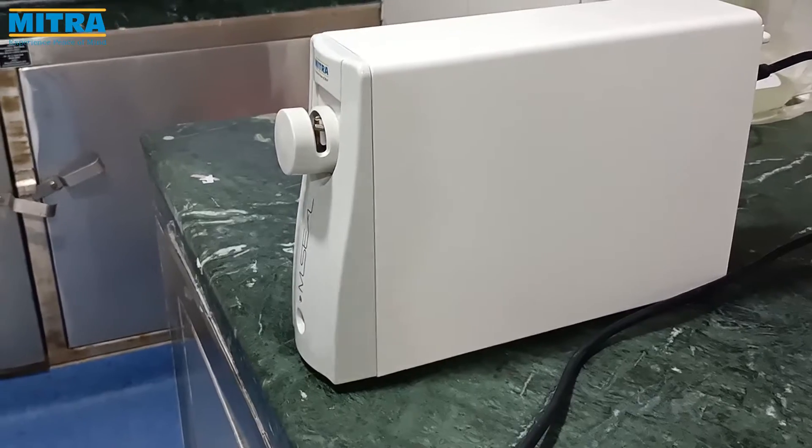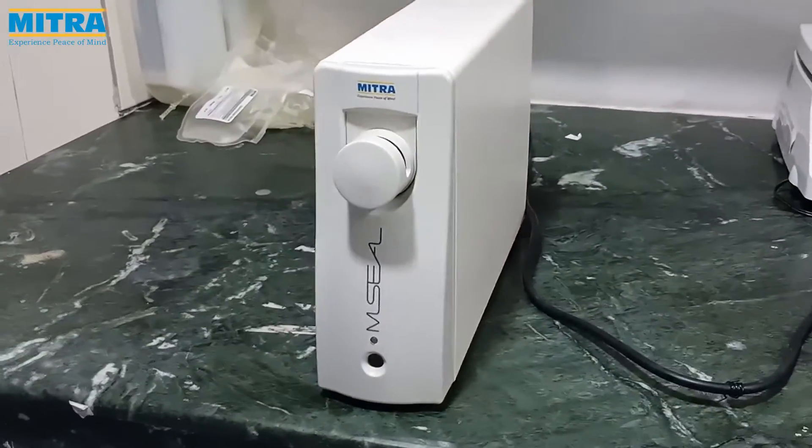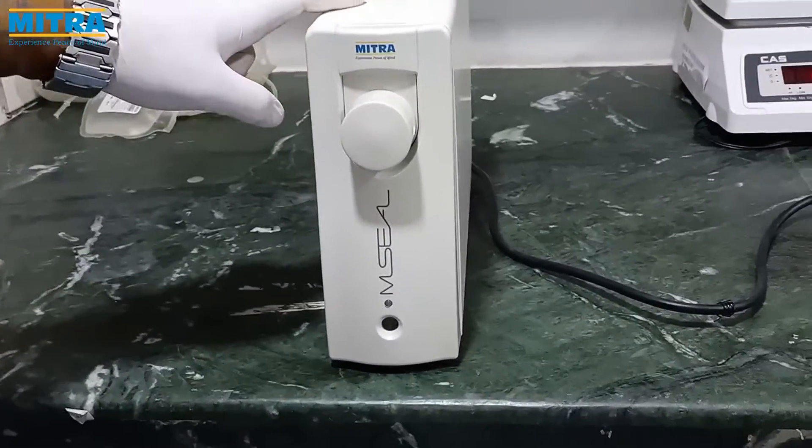Welcome to Mitra Industries. Today we are going to introduce you to the Mitra RF tube sealer and show you how to use it.